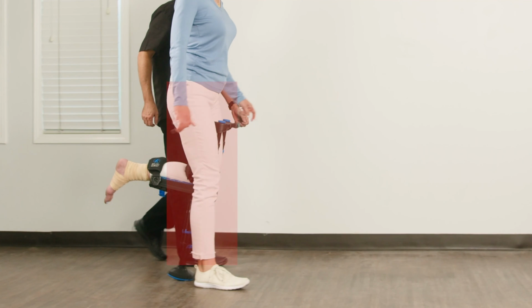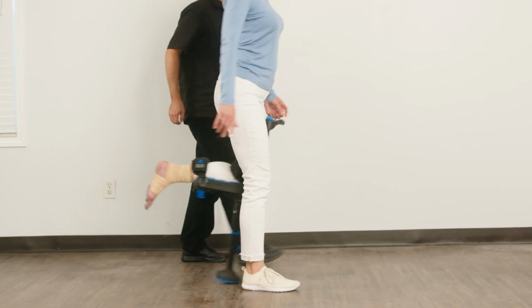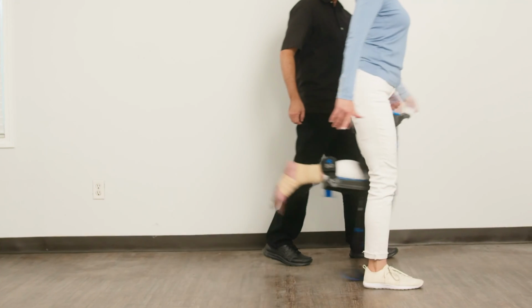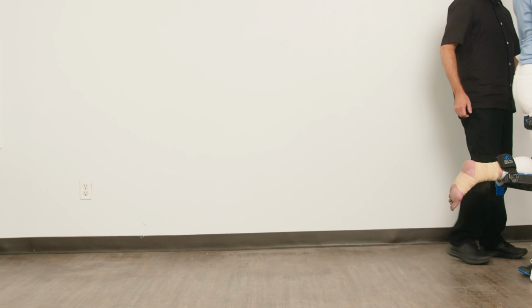Fatigue or mild soreness in the good leg, glutes, and lower back are not uncommon, as new patients often over-recruit their good leg. These issues will typically self-resolve in the first couple days as the patient gains proficiency. If it persists, you can also try raising the lower leg height adjustment.